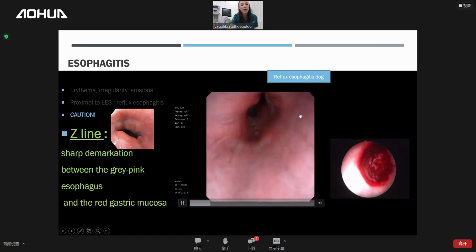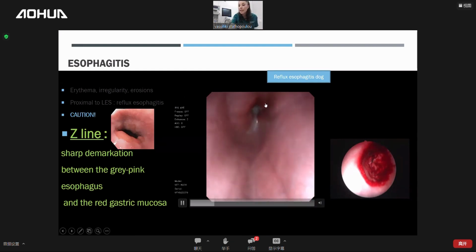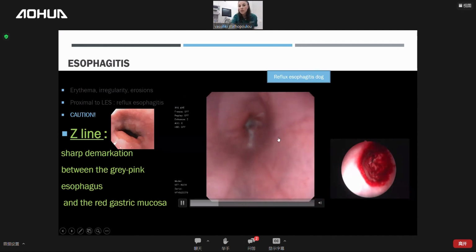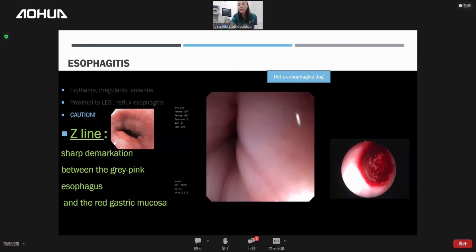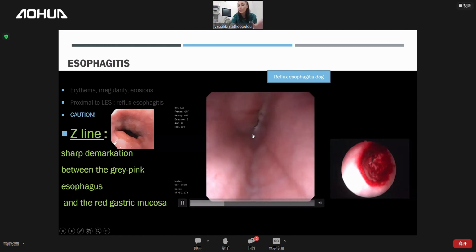The esophagus is very much normal. Of course, the esophageal sphincter was open, and I don't like that because I want it to be closed. And you see that there is a lot of fluid retrograding from the stomach into the lumen of the esophagus, and it stays wide open. You see, reflux disease, but it doesn't have any esophagitis yet. Will this dog proceed into having esophagitis? Highly probable, unless it is out of the anesthetic episode.